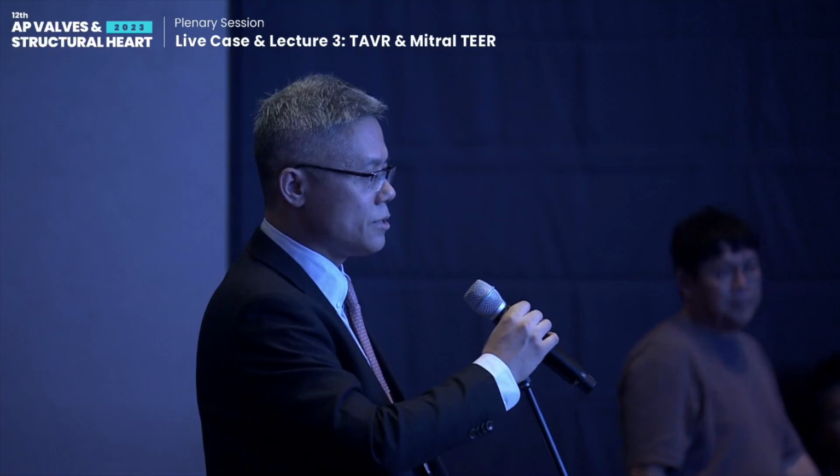In China, the J-Valve is available. They use an anchoring system for the aortic root, but VitaFlow 2 seems to have no anchoring system. Could you comment on how you achieve anchoring well in an enlarged aortic annulus area? That is my key question. Yes, thank you very much, Dr. Park. It's also a very important question.